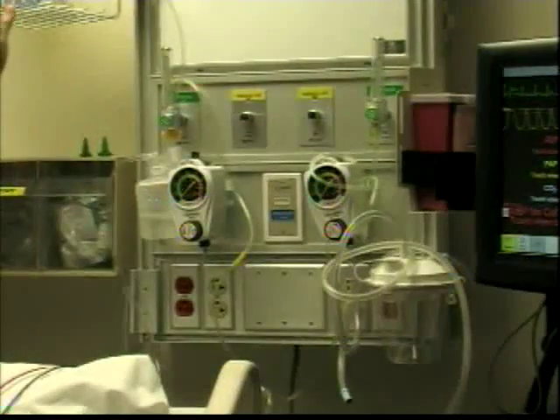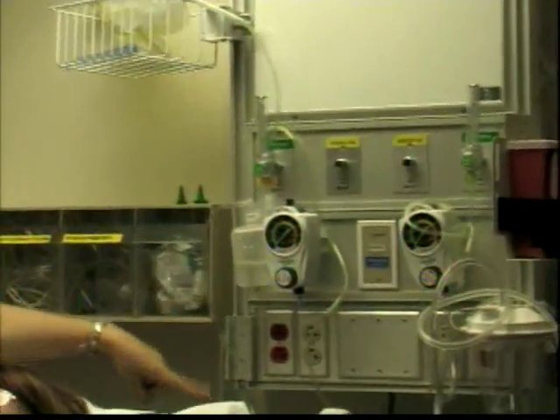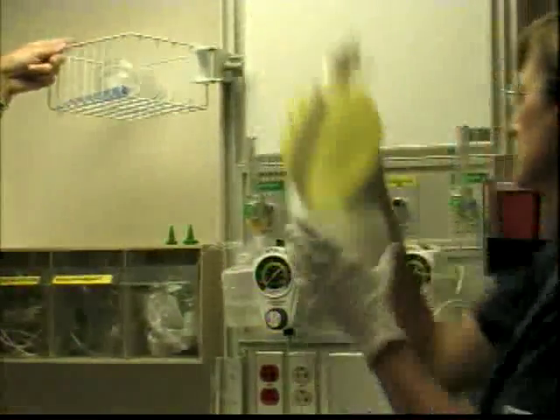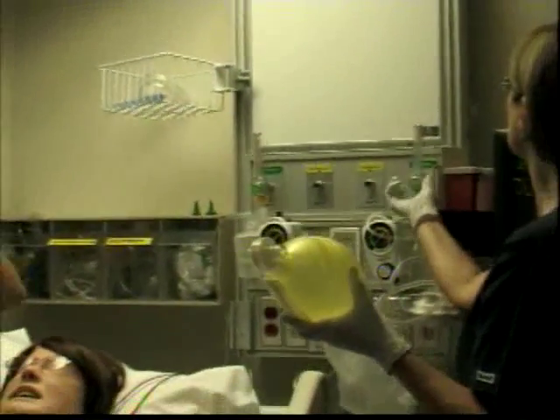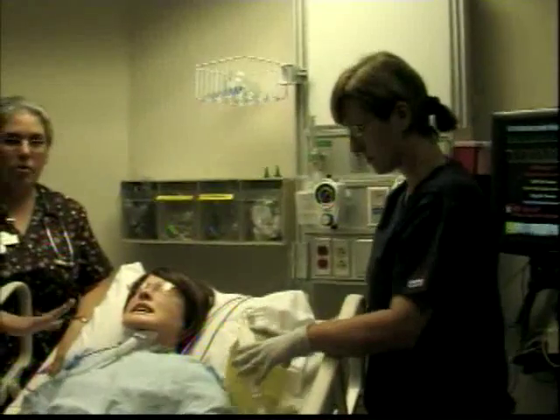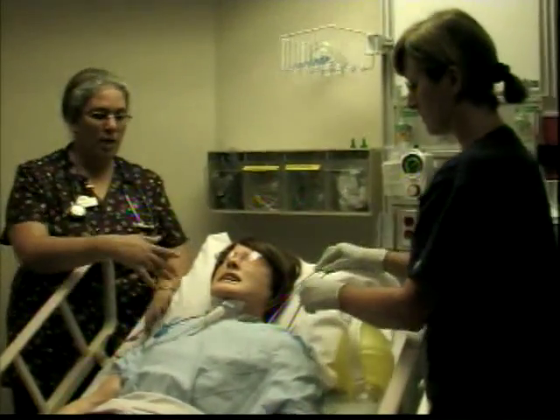We don't want that going into an Ambu bag. So you want to make sure you have a source that you can connect directly into the Ambu bag that can give high concentrations of oxygen, and that's exactly what she just did. You want to direct her to get all that ready and start hyperoxygenating the patient while I'm getting my supplies and equipment ready. So that's what she's going to do.